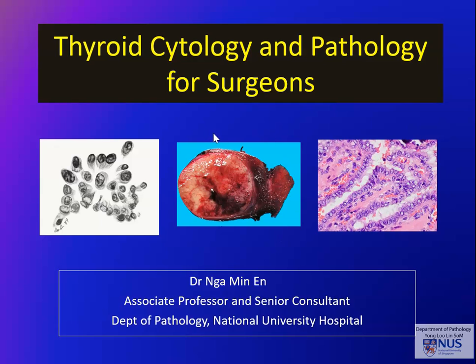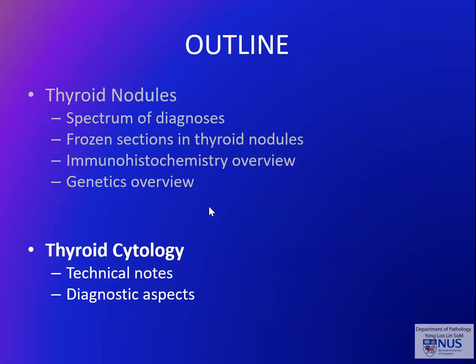Hello, this is the second part of the video lecture on thyroid cytology and pathology, and this is primarily aimed at surgeons as well as surgical residents so that you can better understand how it is that we make our diagnosis. In the previous talk, I focused on thyroid nodules. Now I'm going to look at thyroid cytology.